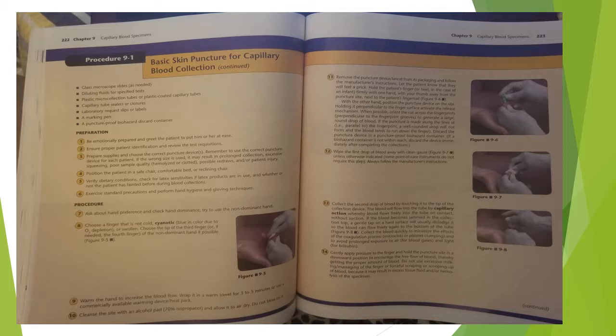Hold the patient's finger, or heel in the case of an infant, firmly with one hand with your thumb away from the puncture site next to the patient's fingernail. With the other hand, position the puncture device on the site, holding it perpendicular to the finger surface. Activate the release mechanism. When possible, orient the cut across the fingerprints, perpendicular to the fingerprint grooves, to generate a large round drop of blood.